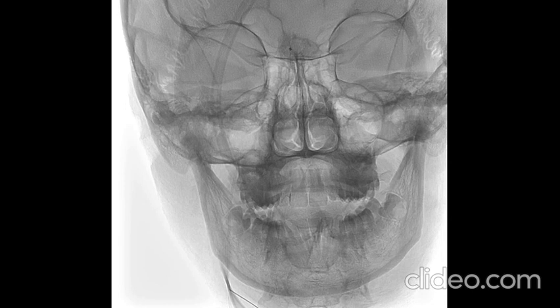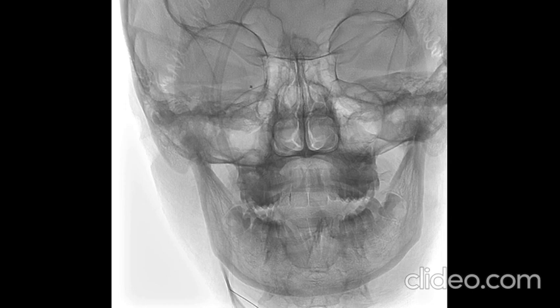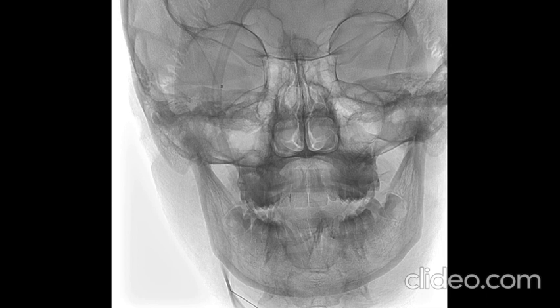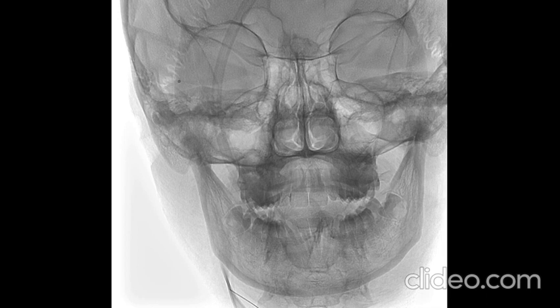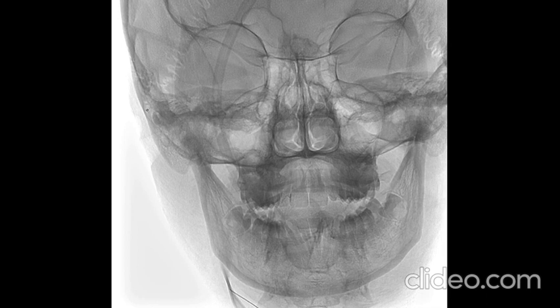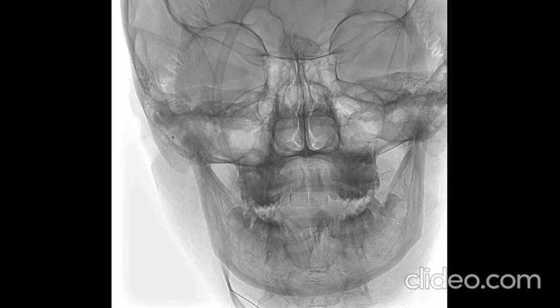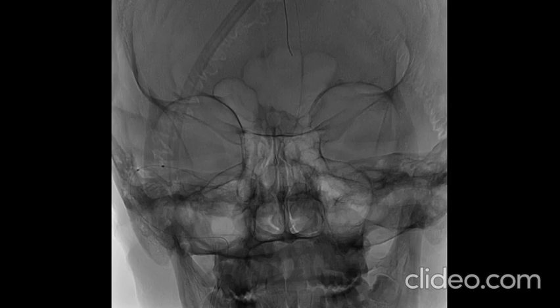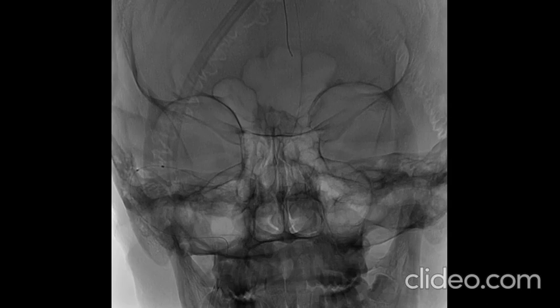After connecting the SL10 microcatheter to a pressure monitoring line and calibrating it, the microcatheter was navigated into the superior sagittal sinus and then pulled back incrementally into the jugular bulb, measuring venous pressure at different points along the track.